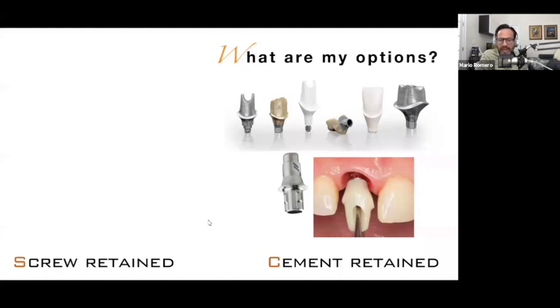But one of the issues that I have found a couple of times in some clinical cases is that when they're not bonded correctly, you see that this can spin. It will debond, and that is a problem. So just keep that in mind, for all the listeners. Make sure that you interact with your lab technician. Make sure that they're doing a really good job bonding these two pieces together, using the appropriate bonding primers for the zirconia and for the metal, so that there is a really good and tight bonding between both pieces, because that is a problem.